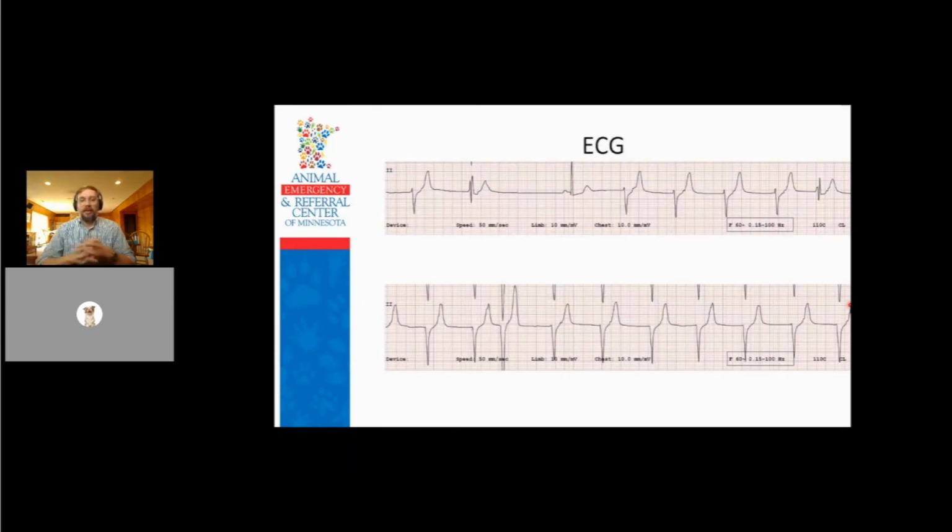So on this top strip, we have a pause, we have a sinus beat, and we have a slow ventricular rhythm, and it's like one comes in. When I see that, especially in a hospitalized patient like a post-op GDV, I'm starting to lean towards at least managing it in hospital. Maybe I would start this dog on lidocaine.